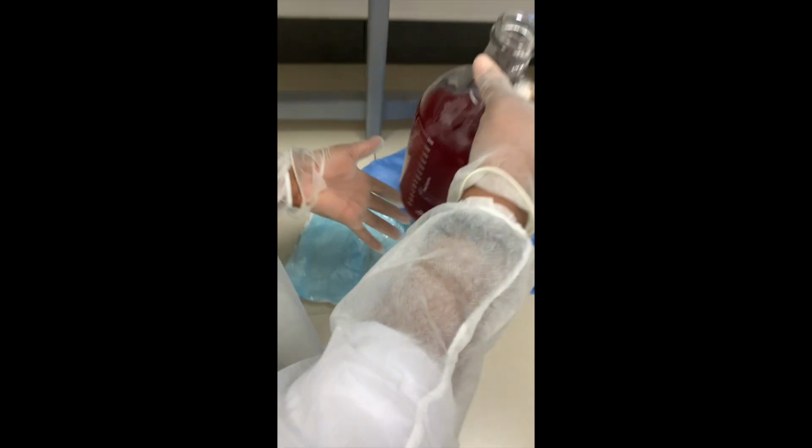So this is how much fluid. Afterwards I secured the line on the abdomen and just let it drain and let it drain. We got about 3 big bottles from this tapping. I was happy and I felt fulfilled.